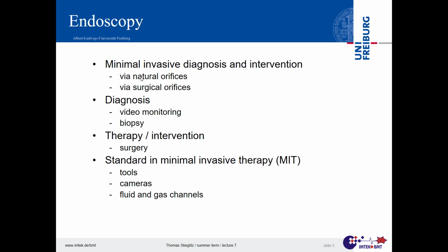It's dark inside the body, that's one thing, so you don't see anything. You need a kind of torch or light, and there's not much space. And if you want to see something, you should make some space, for example. That means blowing in some gas and inflating everything, and then the question is, how much can I inflate something before I create some damage?